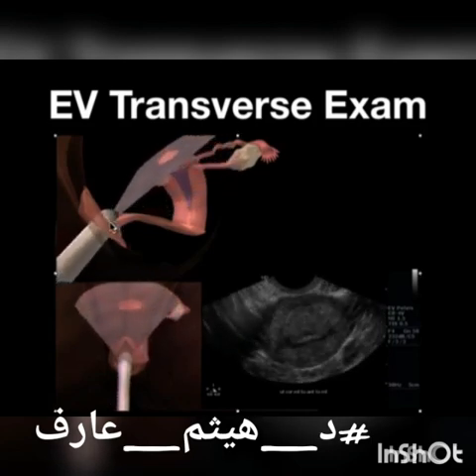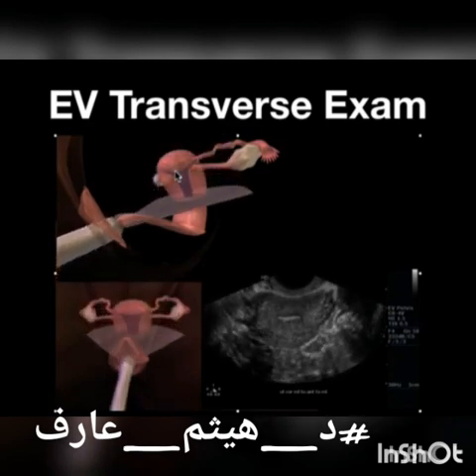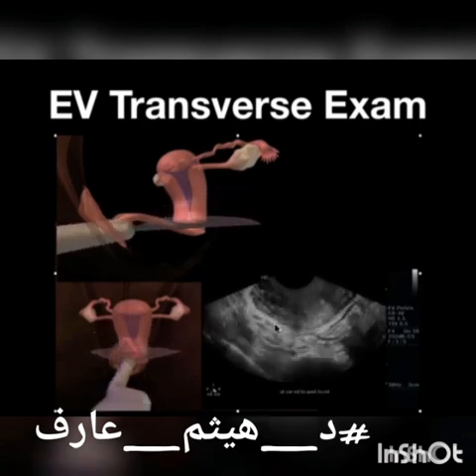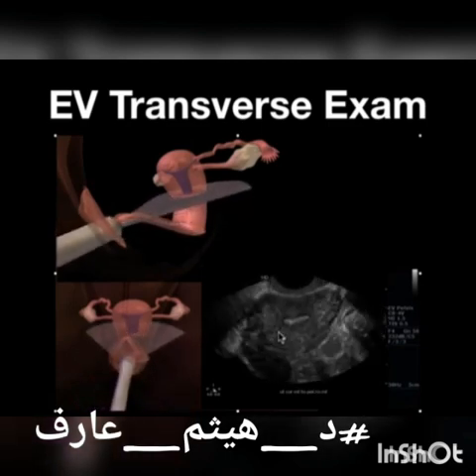You can see in a patient with an anteverted uterus, by bringing the handle down, you're going to evaluate the uterine fundus. And by bringing the handle up, you're going to be shooting the beam more posteriorly, and you'll be going into the lower uterine and cervical region. So again, make sure when you perform this exam that you do a full sweep going from the cervical region all the way through the fundus.